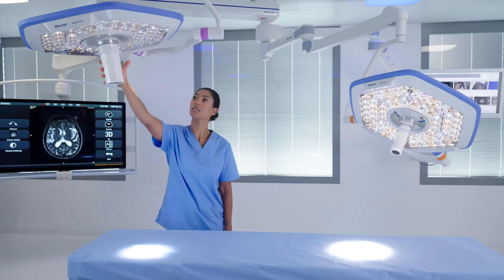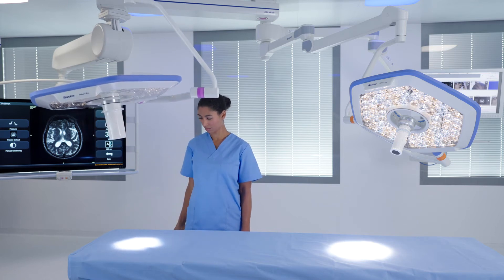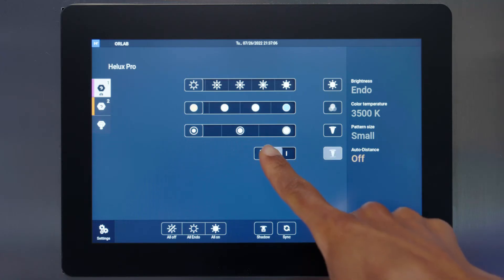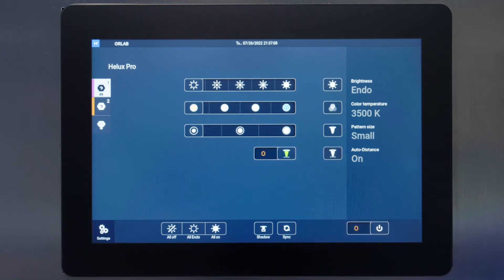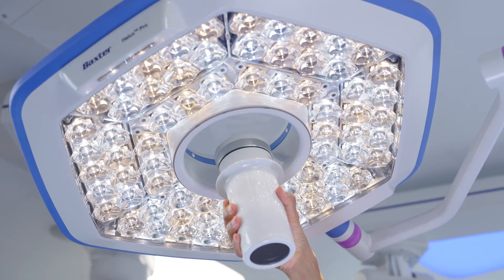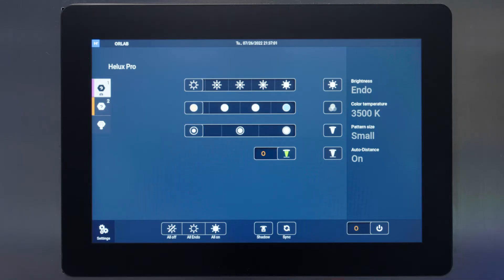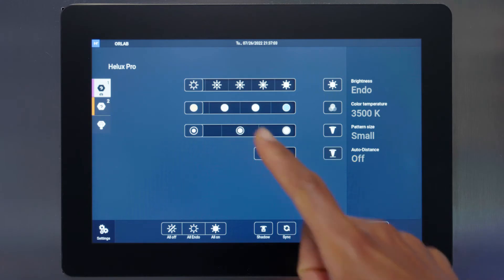The Auto Distance or ALC Plus feature ensures a consistent illumination level when the light is repositioned without the need for manual readjustment. When ALC Plus is enabled on the wall control, simply adjust the light and the 3D sensor will measure the distance between the light head and the surgical site. ALC Plus can be deactivated by turning Auto Distance off at the wall control.